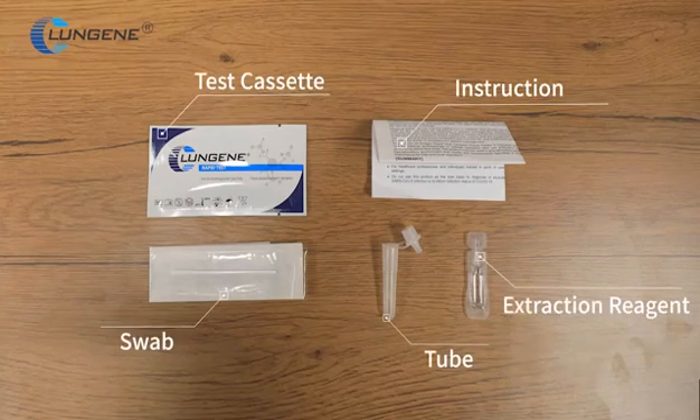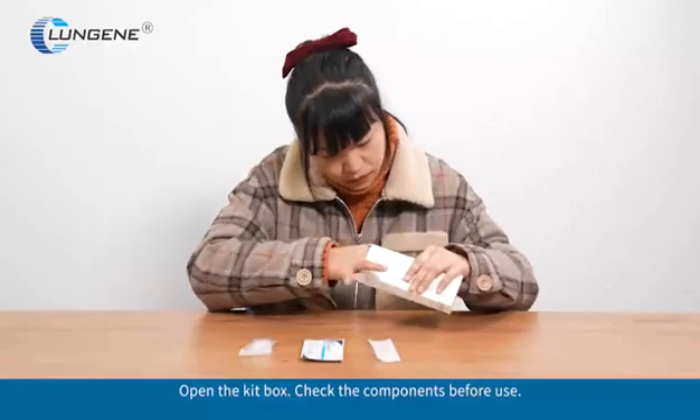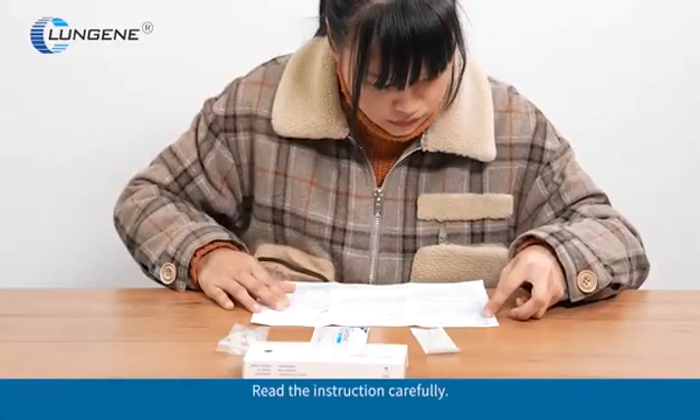COVID-19 Antigen Rapid Test Self-Testing Test Procedure. Open the kit box and check the components before use. Read the instructions carefully.